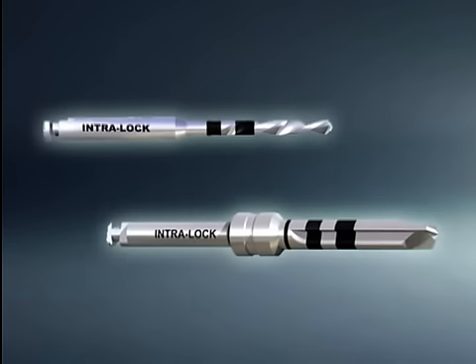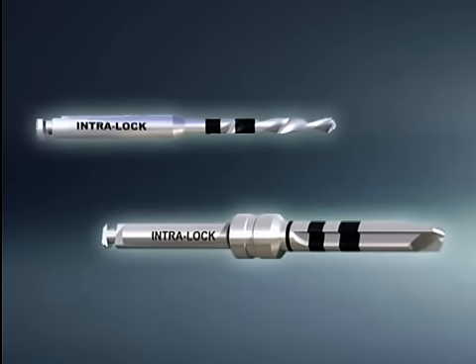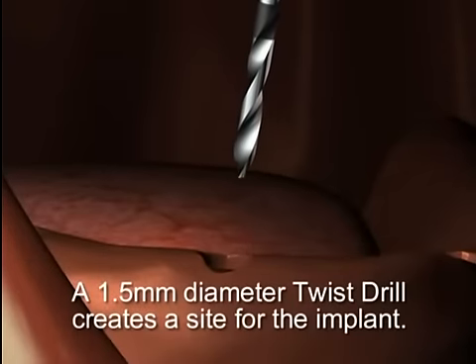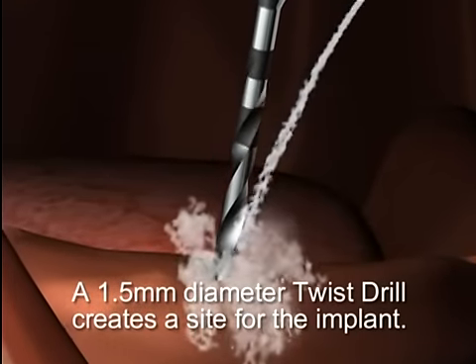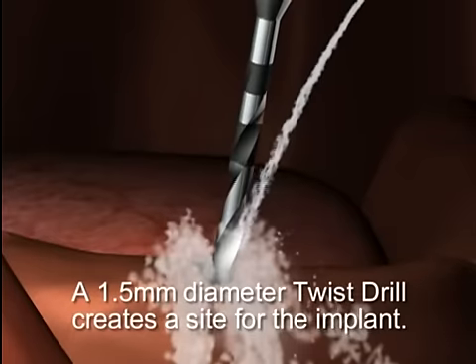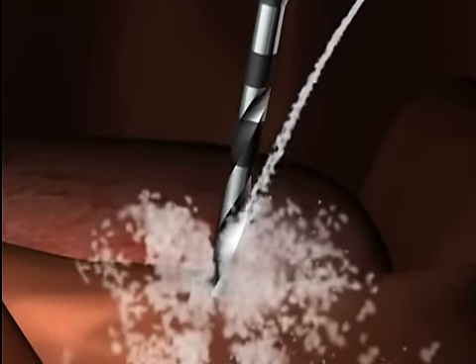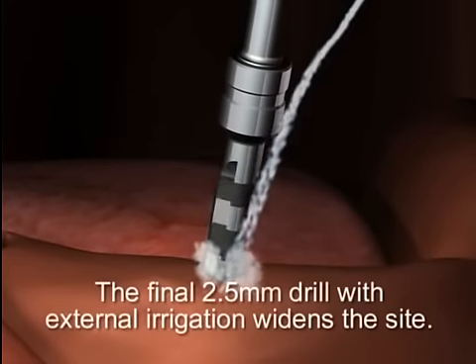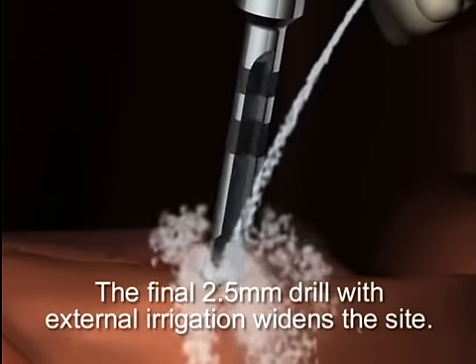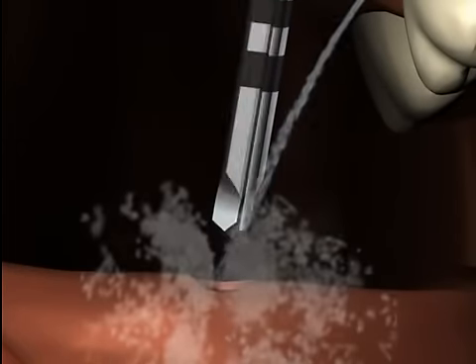Laser-etched depth marks on the drill correspond to the length of the selected MILO implant. Use a 1.5 millimeter diameter twist drill at 1000 to 2000 RPM to create an initial implant site. Drilling is accomplished by using an up and down pumping action. Light, repeated, intermediate vertical introduction of the final 2.5 millimeter diameter drill at 500 to 1000 RPM widens the site.